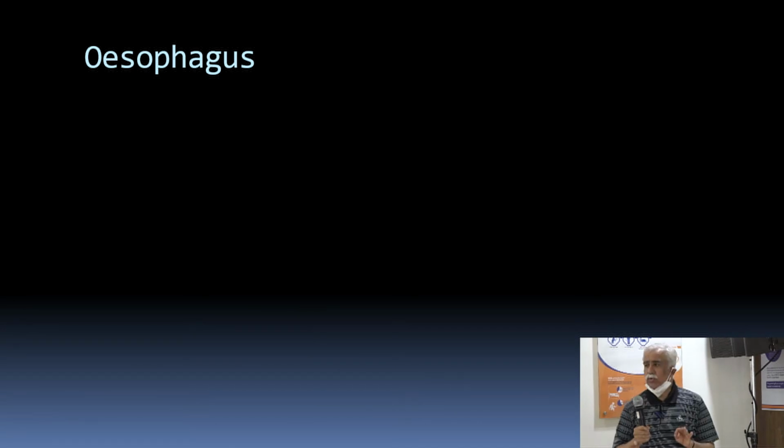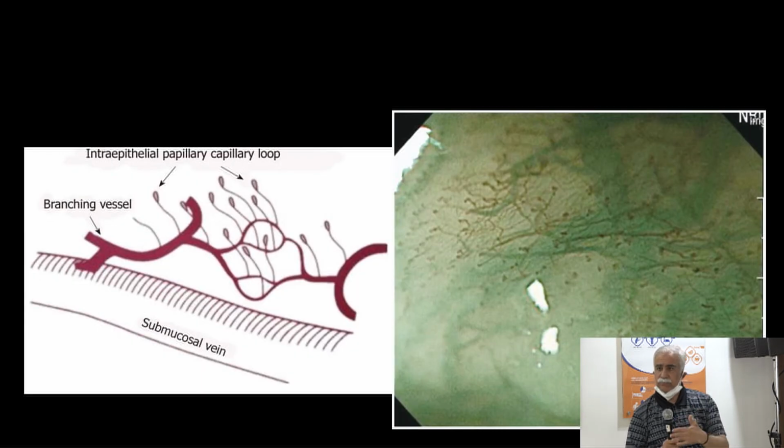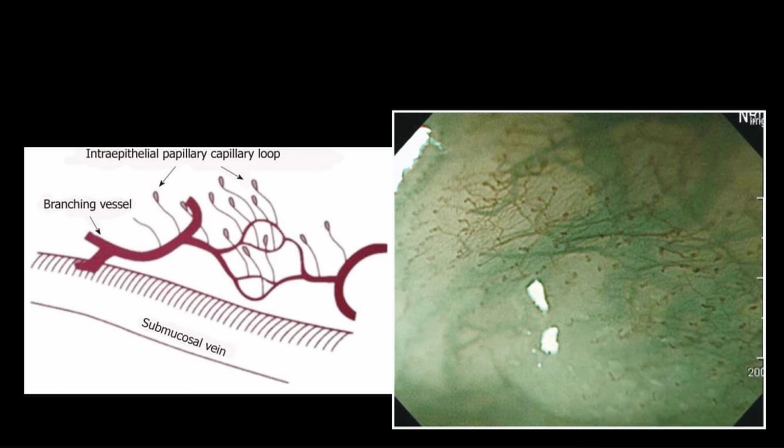So I'll just show you normal appearances of esophagus and stomach, and then we will. In the meantime, you can ask them to have the first patient on the table, and we'll be ready.